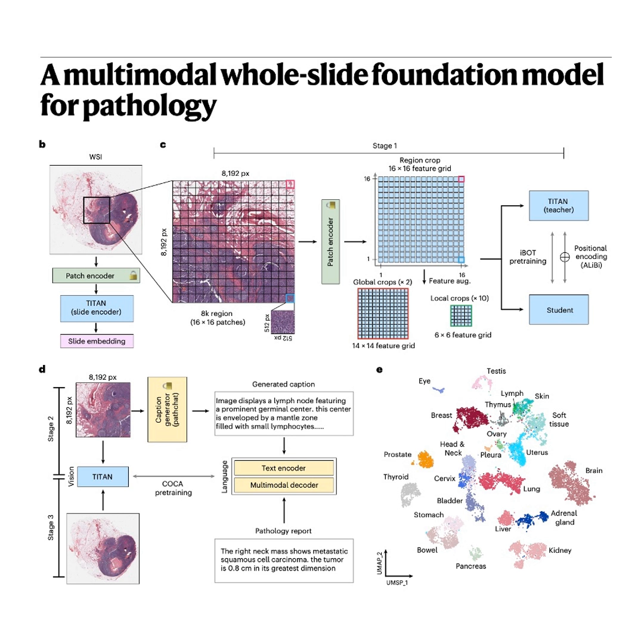Okay, let's unpack that. It's a monumental undertaking. If the older models could only handle those tiny tiles, the little ROIs, how does Titan make that conceptual leap to understanding the entire gigapixel slide? What's happening in stage one? So stage one is the vision-only pre-training phase. They call it Titan V. And the big conceptual shift here is moving away from training on raw pixels and moving towards training on feature summaries. Okay, explain that for those of us who aren't machine learning engineers.